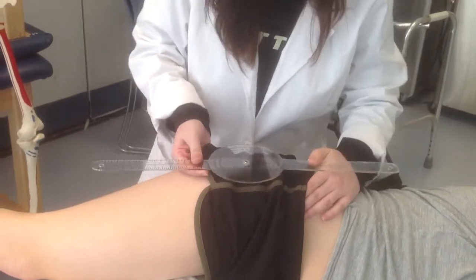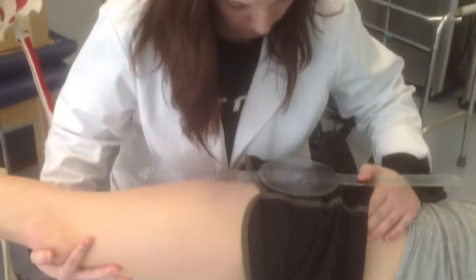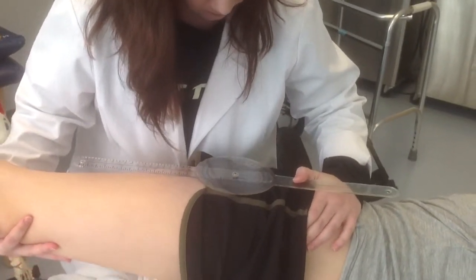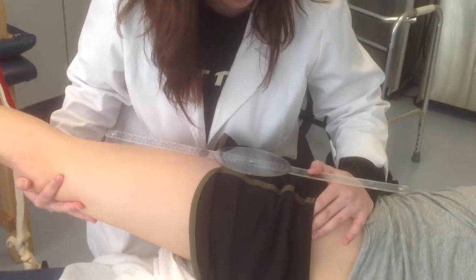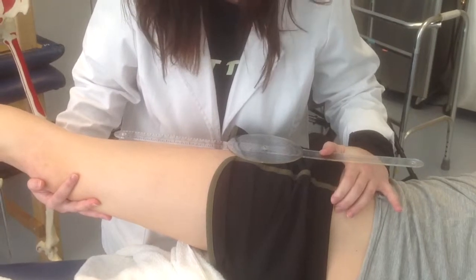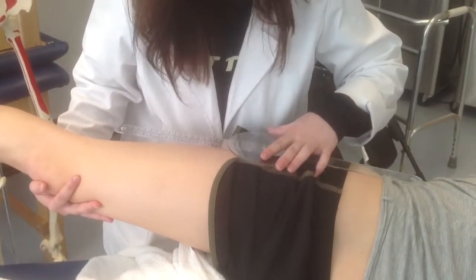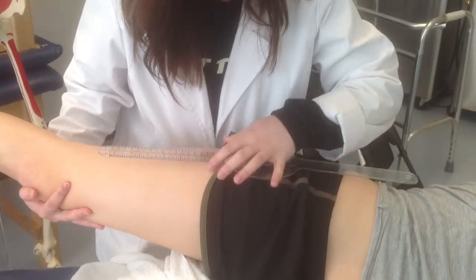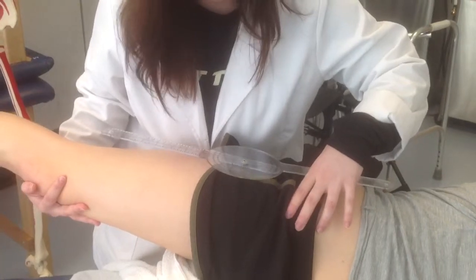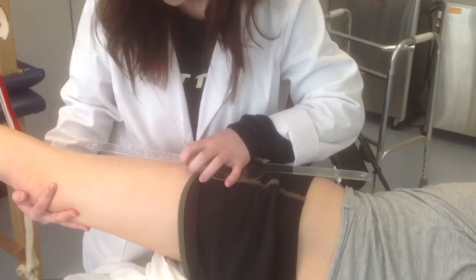And I'm going to take her into extension passively. The end feel is firm because of tension in the anterior joint capsule and the iliofemoral ligament, and to a lesser extent, the ischiofemoral and pubofemoral ligaments. Tension in various muscles that flex the hip, such as the iliopsoas, sartorius, tensor fasciae latae, gracilis, and adductor longus, may contribute to the firm end feel.